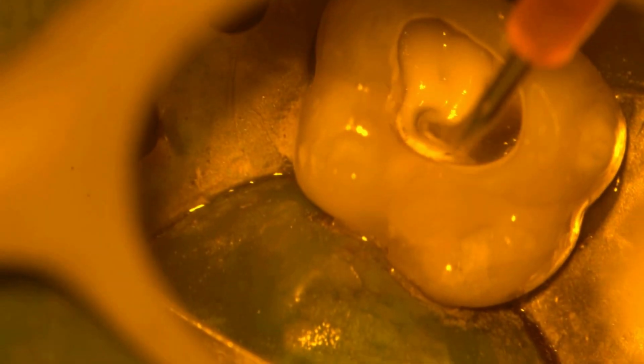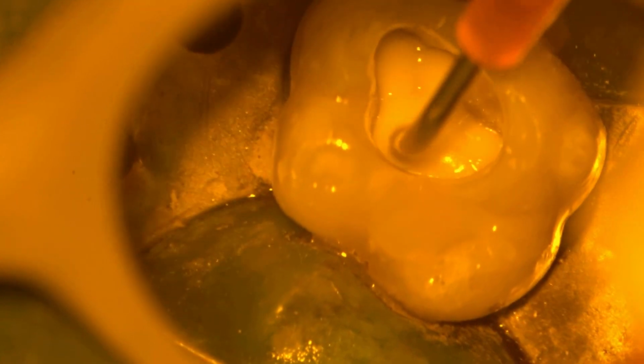Light curing the bonding agent, the Photobond. It's a dual cure. And at the same time I'm having my assistant mix the LuxaCore and place it in a needle tip Centrix syringe. And I'll introduce that in layers, covering the floor with a thin layer so that it shrinks back without a gap. And then I just line it up the walls like the ribs of a boat so it'll shrink against the wall and have strength with some idealized dentin bonding.